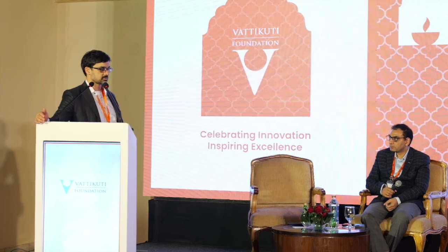Yeah, and fortunately in the States, we tend to find smaller cancers now with lung cancer screening and such. So a big discussion is how to identify those tumors with no tactile feedback, no visual cues, and this provides a benefit.